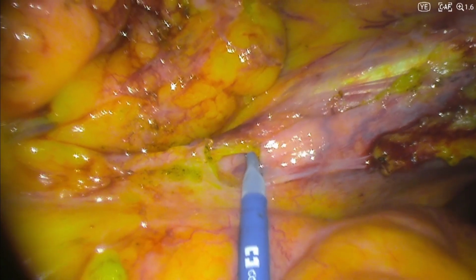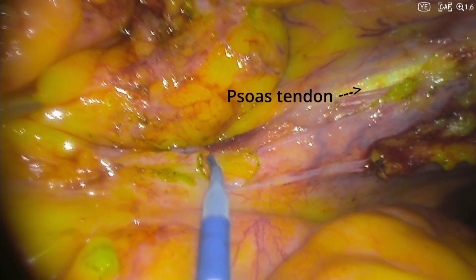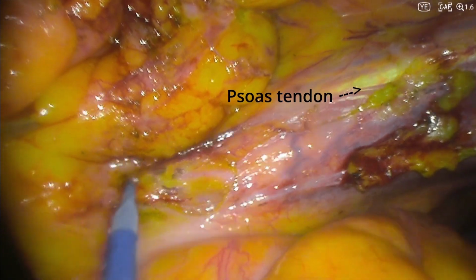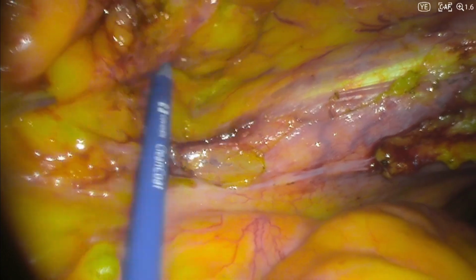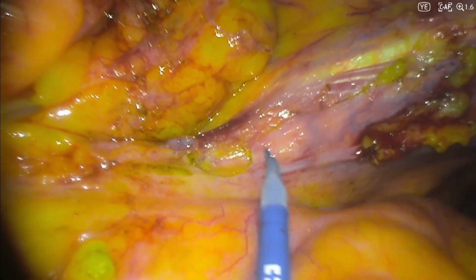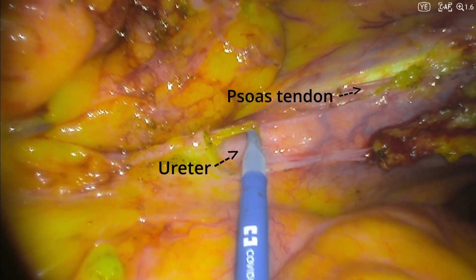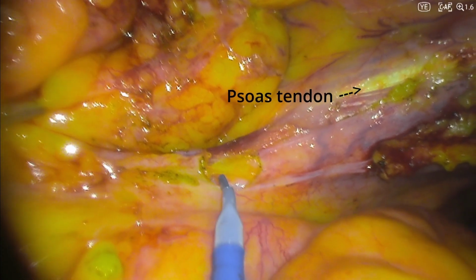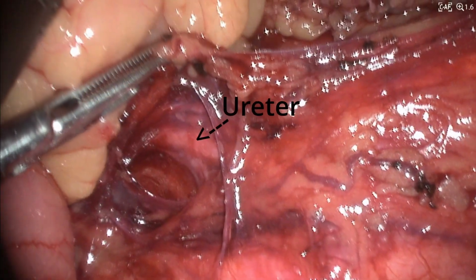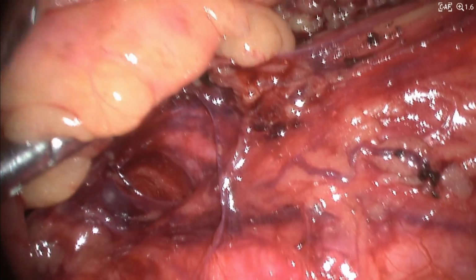As shown here, the ureter was identified prior to tracing and ligating the inferior mesenteric artery, as injury to the ureters usually occurs when taking the inferior mesenteric artery or vein. In this patient, a lot of adipose tissue had to be dissected before encountering the left ureter. Without the enhancement, identification of the ureters would have been difficult due to the adipositas surrounding it. Here is the ureter in the patient without yellow enhancement, and we can see the ureter is a lot paler and may not be distinguished easily from the fat tissue that may surround it.